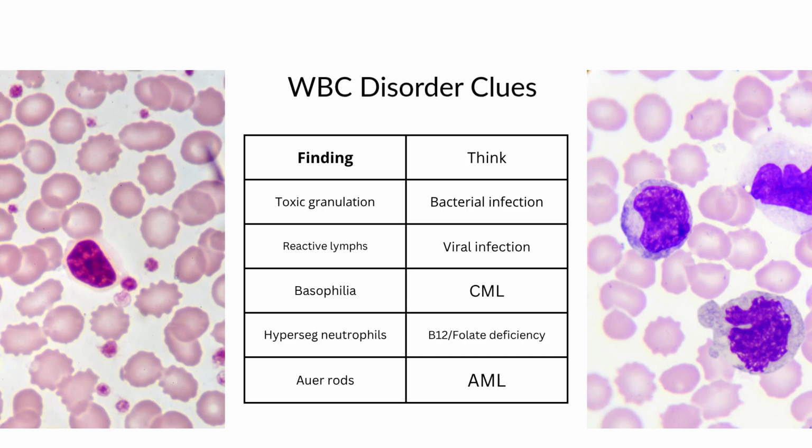These are classically associated with chronic lymphocytic leukemias. These patients often have many mature-looking lymphocytes that are very fragile. So CLL gets smudgy. That's a good way for you to remember this. CLL gets smudgy. Important: CLL is usually seen in older adults.